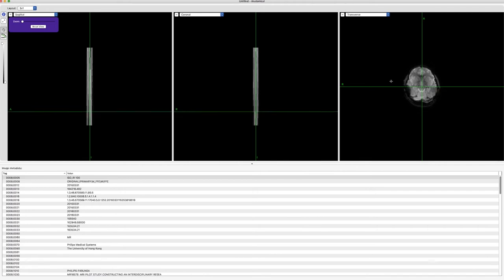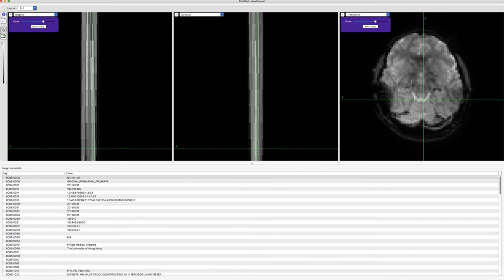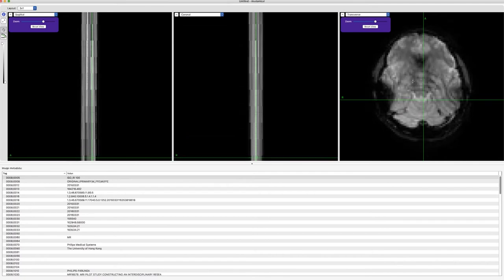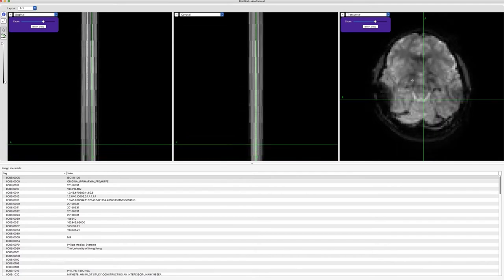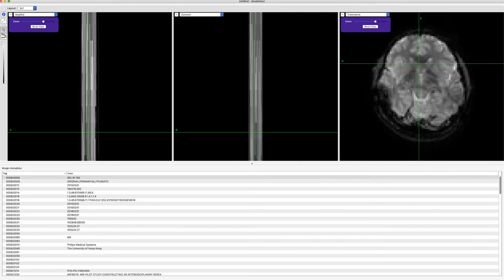so we'll have to see, we've got our PC just there, if I was to zoom in on that structure there. So I'd have to have a look at those resolution. The resolution of this is unusual. Normally we wouldn't see it that pixelated. But yeah, so we can set those atlas spaces there.